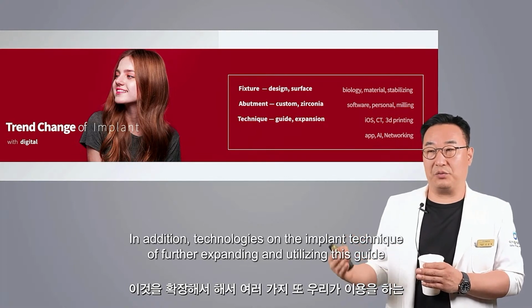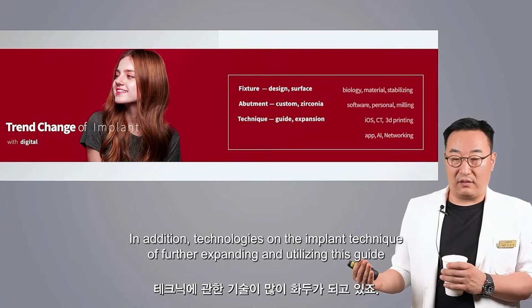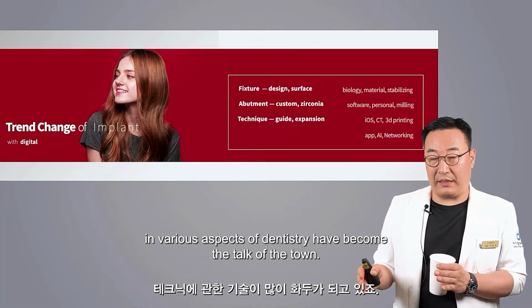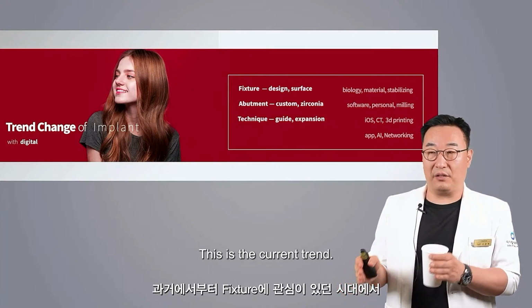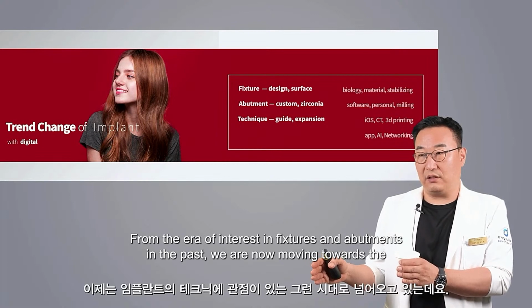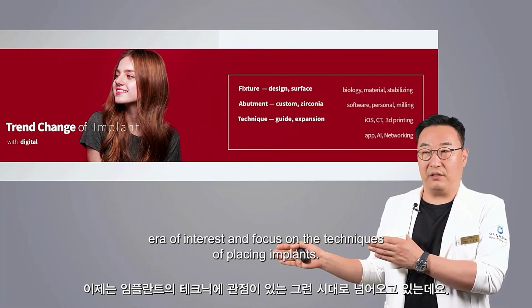In addition, technologies on the implant technique of further expanding and utilizing this guide in various aspects of dentistry have become the talk of the town. This is the current trend. From the era of interest in fixtures and abutments in the past, we are now moving towards the era of interest and focus on the techniques of placing implants.